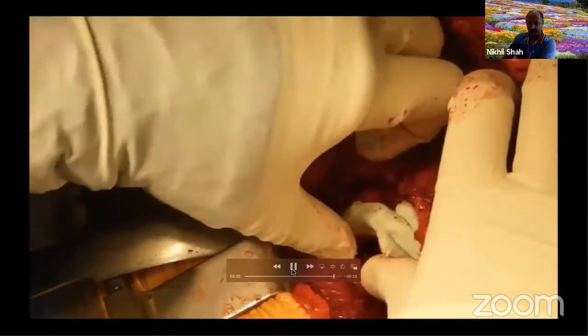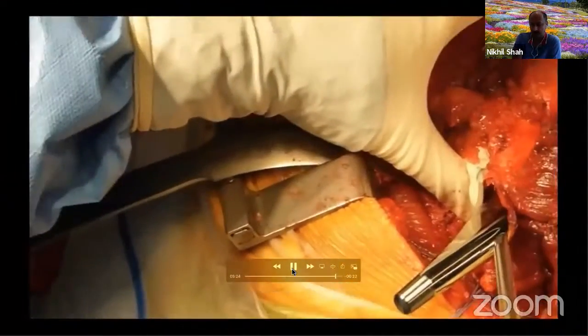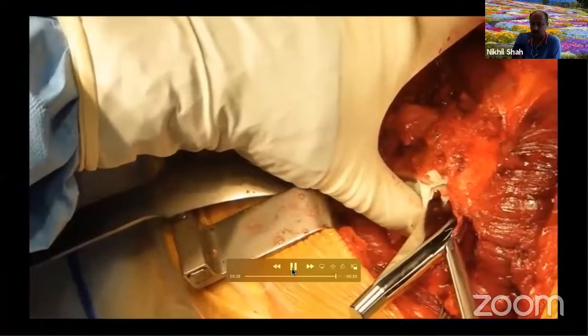And this is an additional step that I do. This is something more of tradition. With your thumb, you pressurize it. And then that's the C stem going in.